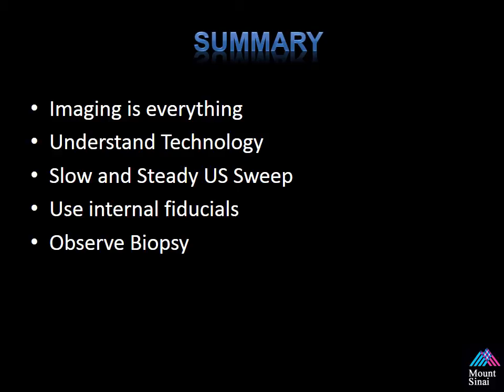allowing you to see the shortfalls of maybe poor segmentation that you're able to correct for during the procedure, as well as how EM tracking and surface rendering works to understand how important your sweep is. And a slow and steady ultrasound sweep is very important. It's important to make sure you do not deform the prostate during the sweep, or at least use enough pressure that you can mimic if an endorectal coil was used.